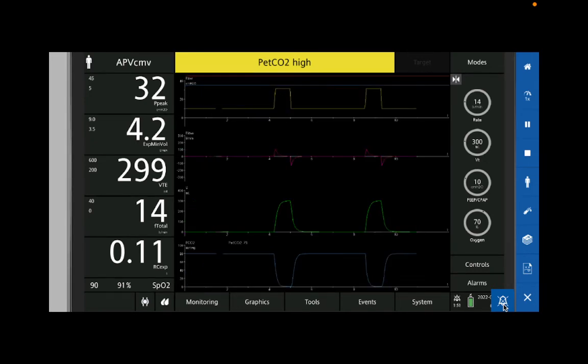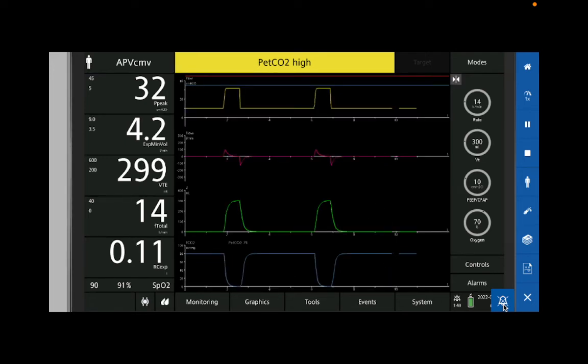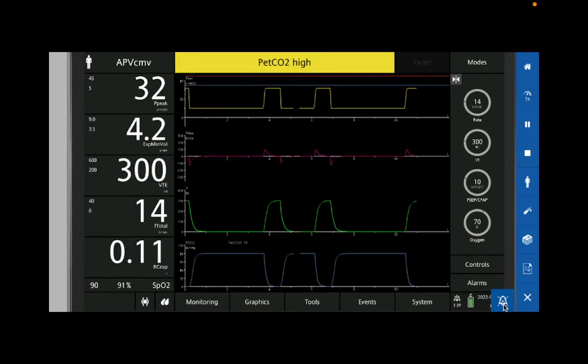He needs to get off CO2, right? He needs to breathe more to get off his CO2. Why is he needing to breathe more often than you guys sitting here breathing at a rate of 12? What's different about him? There are two things going on. One, he's got ARDS. Picture that picture, right? His lungs are full of junk.